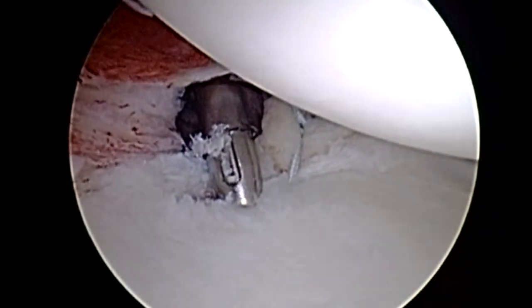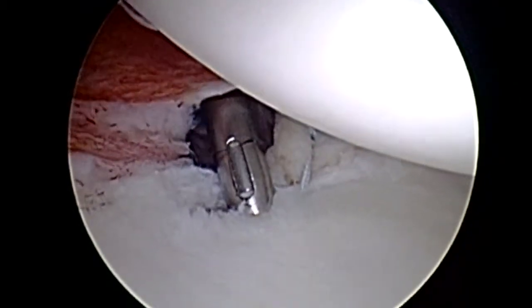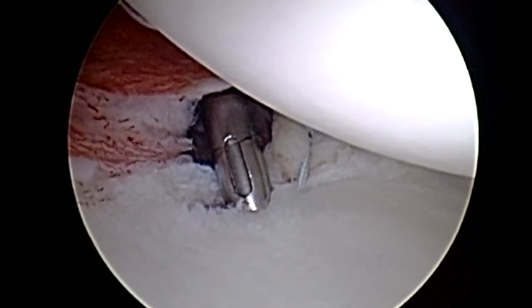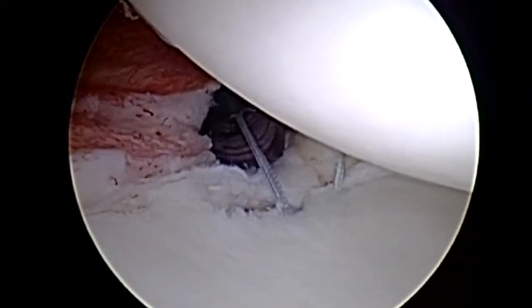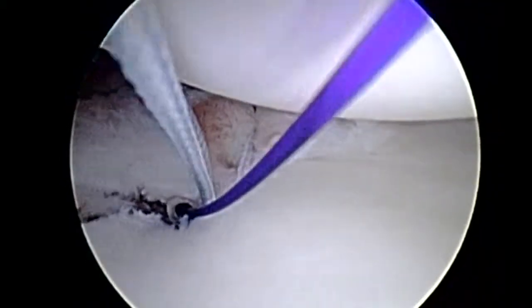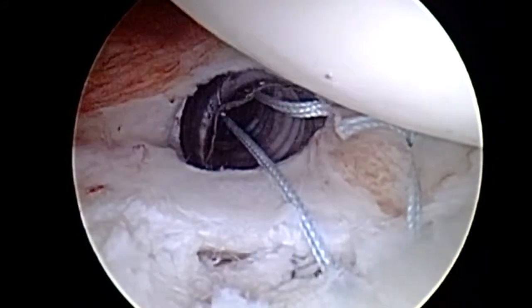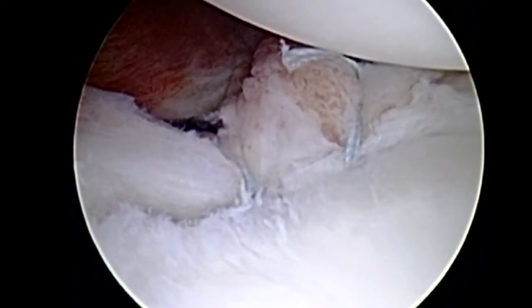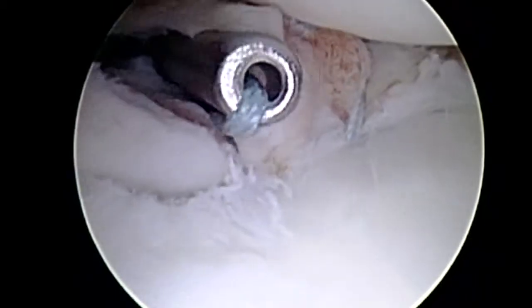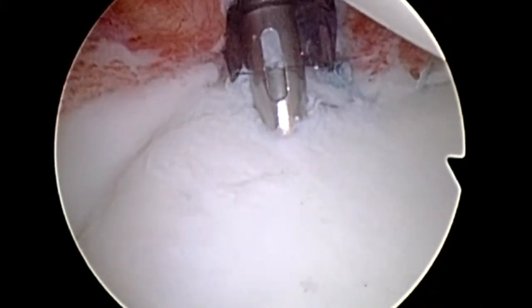We drill our second suture-tack labral anchor and impact it down. There is a nice laser line which shows us the depth to sink the anchor. We then relay one suture out of the accessory anterior portal, use a penetrator to get an excellent bite of labrum and capsule, and tie this down with an arthroscopic sliding locking knot. You can see an excellent restoration of the bumper, and the humeral head is re-centering nicely.